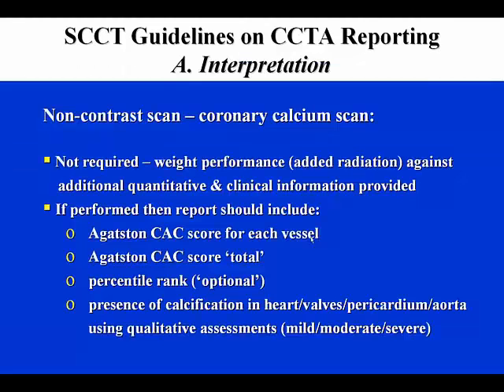Initial interpretation: the non-contrast scan, including coronary calcium scan, is not necessarily required, but is highly recommended by Cardiac CT Training Associates to be done in all patients who have no known prior history of cardiac disease.